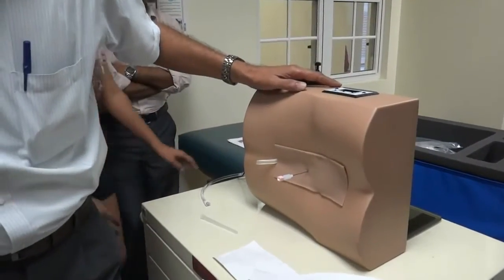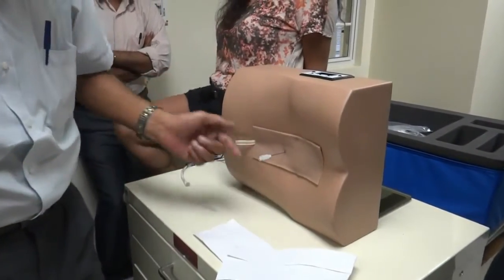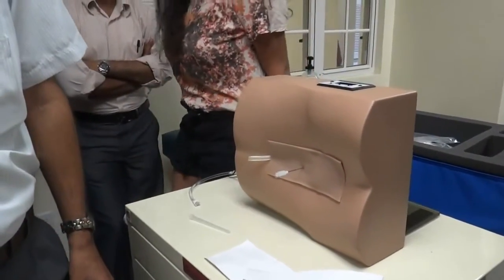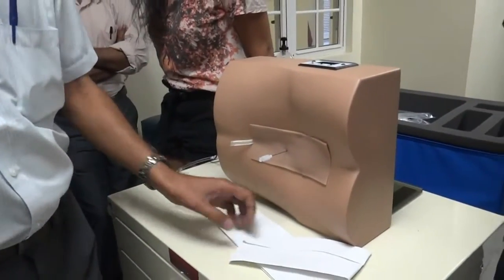Those of you at the back didn't hear it perhaps. You will feel it, don't worry. Very subtle. So this is the real image. Normally, CSF should come out.